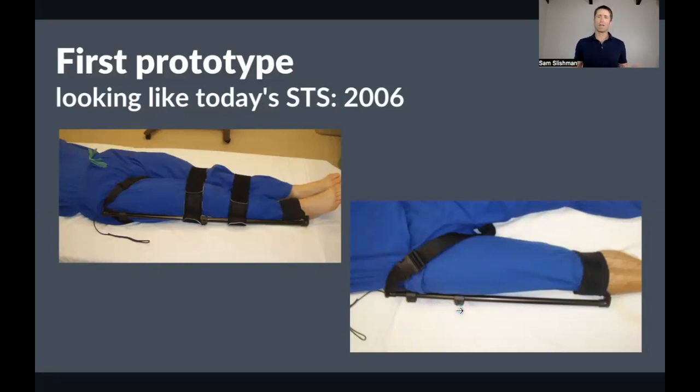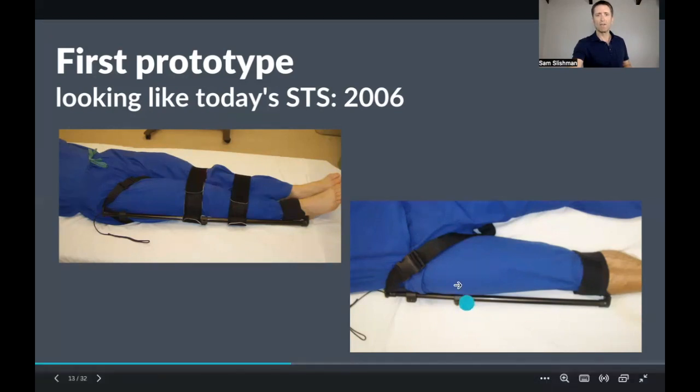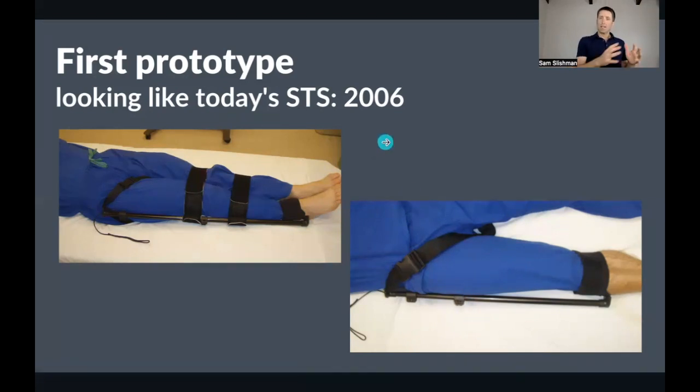And even though they work, it's just a struggle because if it loosens a little bit, people will say, "Oh, this is garbage," because it's slipping. And all you have to do is tighten the screw, but that's enough for people to say, "I don't like it anymore." So we changed it to thumb screws. All right, so that was 2006. You'd like to think that was a decade of success, but really this was a decade of me thinking, what in the world am I doing? There's a lot of time and a lot of money spent and not getting anywhere.